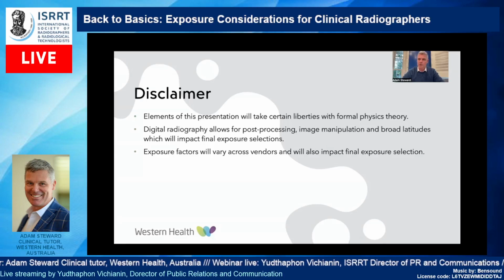It's also important to note that a lot of the exposure considerations we're talking about today really stem from conventional radiography theory, and particularly plain film theory. These are clinical skills and principles that are still true today, but may be different on digital systems, and may need to be treated slightly differently on digital systems that allow for post-processing and image manipulation.